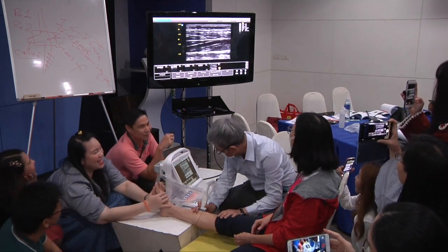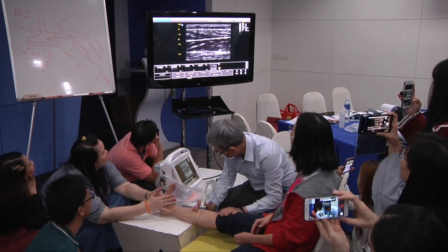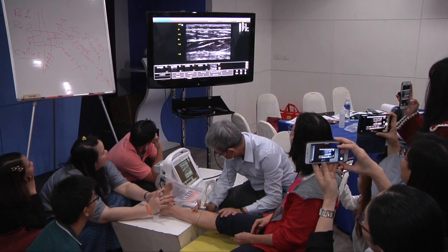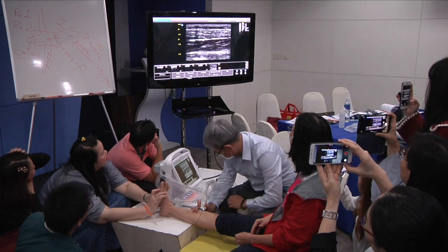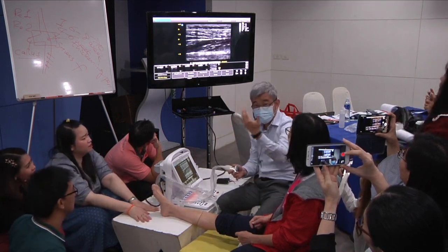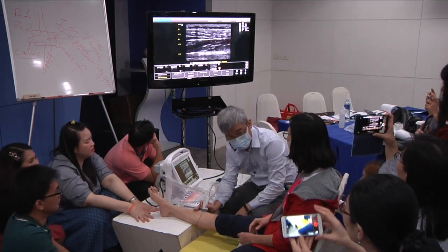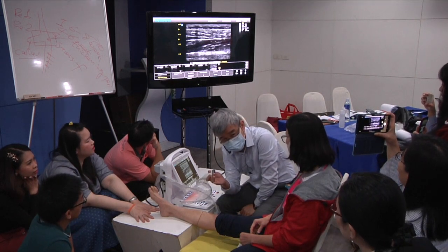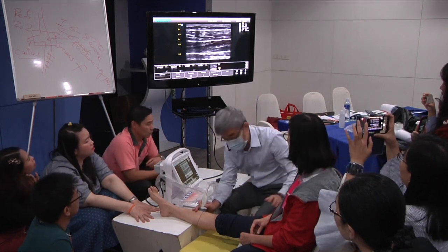Now, let's do it again. Go. Slowly relax. Good. Back. Good. More. Relax. Okay. Do you see the movement? Move distally, proximally. Okay. And the rubber band can help you to make sure your probe is moved or not. Right. Otherwise, don't do anything, okay?